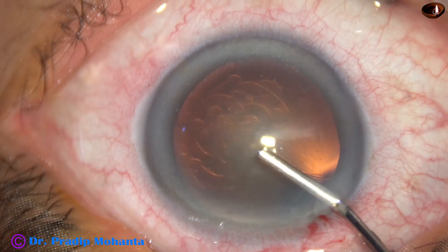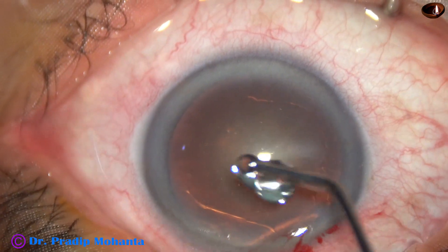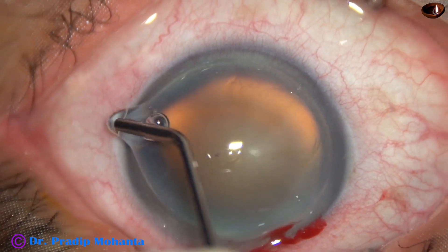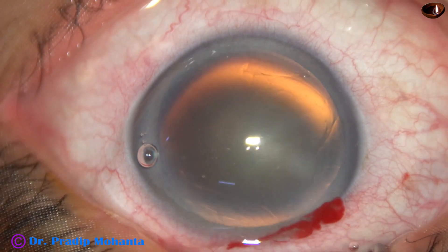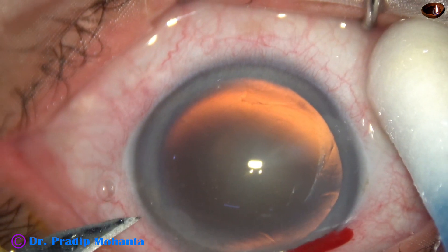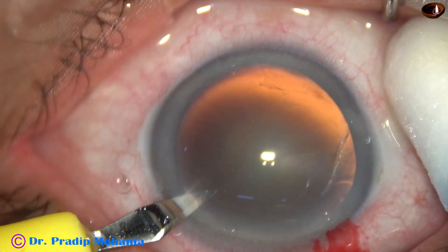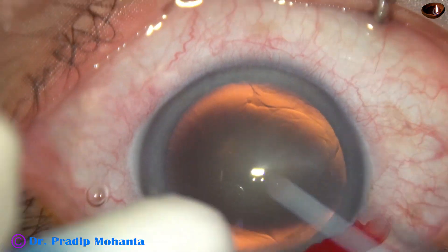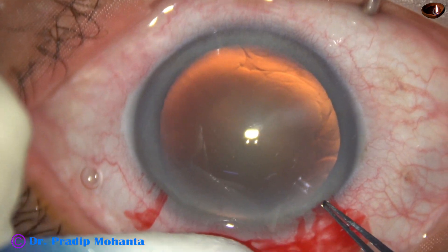Visco is used to fill the anterior chamber and it is applied over the corneal epithelium for better visibility. And now a side port is made on the left side of the main incision, about 3 o'clock hours away. The incisions include some capillaries so that healing becomes better.